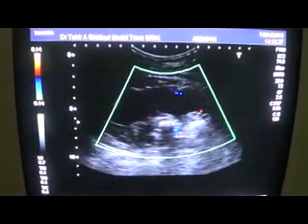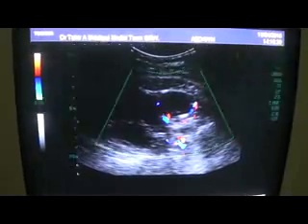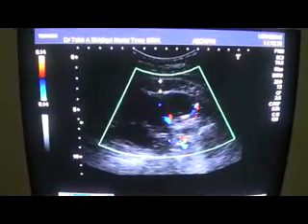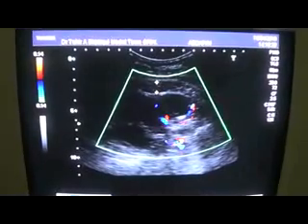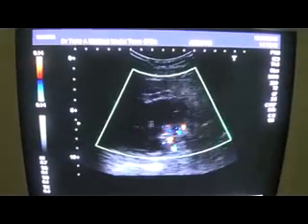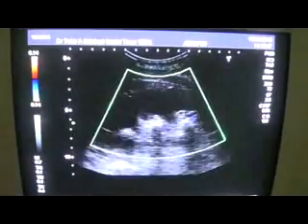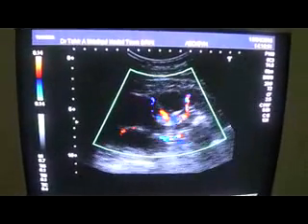On color. Now this is the maximum of the parenchyma at the anterior mid portion that is visualized, measuring 9.7 mm, but we really do not see any blood flow through that region. Internally it is being perfused.